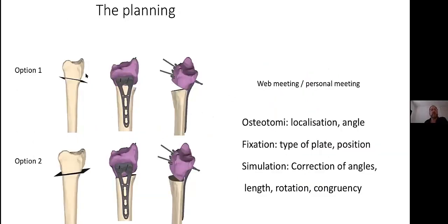So here, if you look at this first cut, if you cut here and you move the distal bone to the desired position, you get this kind of defect in the back. But if you place the cut in a different way here, you get a totally different appearance in this area. And you can also play a little bit with where the screw will catch the bone here.